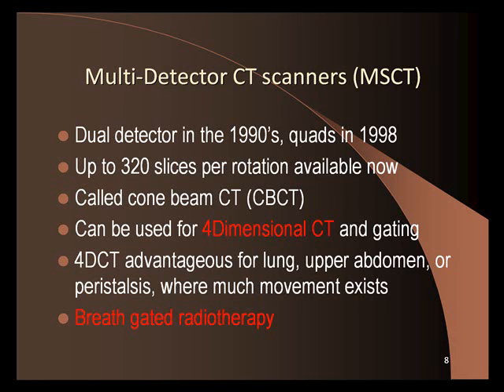These days we want to capture patients' breathing. We want to capture tumor motion. We want to capture, in cardiac studies, how the heart beats. Okay? And those are called gated studies. So with these quicker CT scanners, we can now capture 4D CT. So we can have entire CT scans for every portion of the breathing cycle.